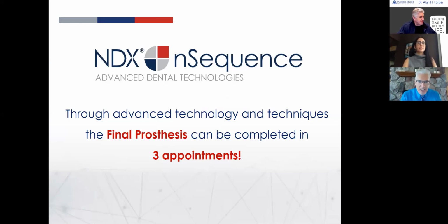To get to the final, let's stop for a moment here. Where we're at right now, you've had the day of surgeries taking place. That may have been 4, 5, 6 months, whatever Dr. Farber's protocol is on integration time. What I'm going to share with you is, what are we going to do for the final.